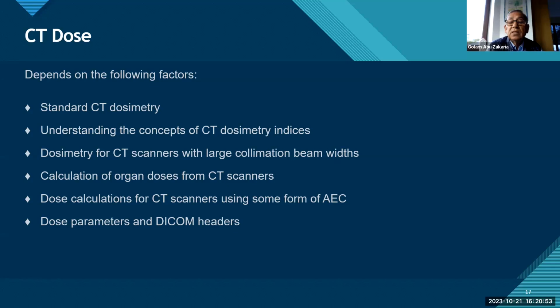AEC is also actually a very useful tool. In earlier times, there was no AEC in computed tomography. Therefore, we overexposed the children. Now, for every patient, according to the body, it adjusts the voltage and, of course, the current.